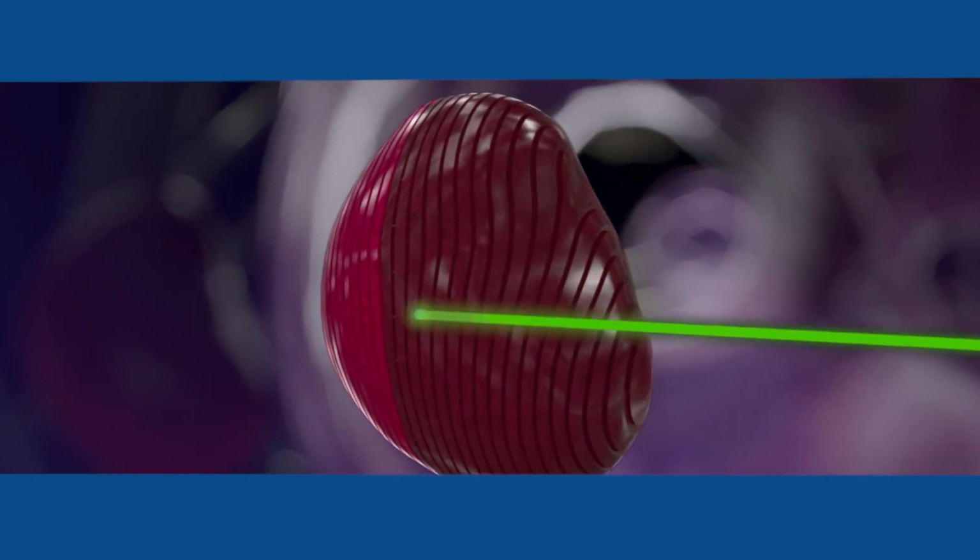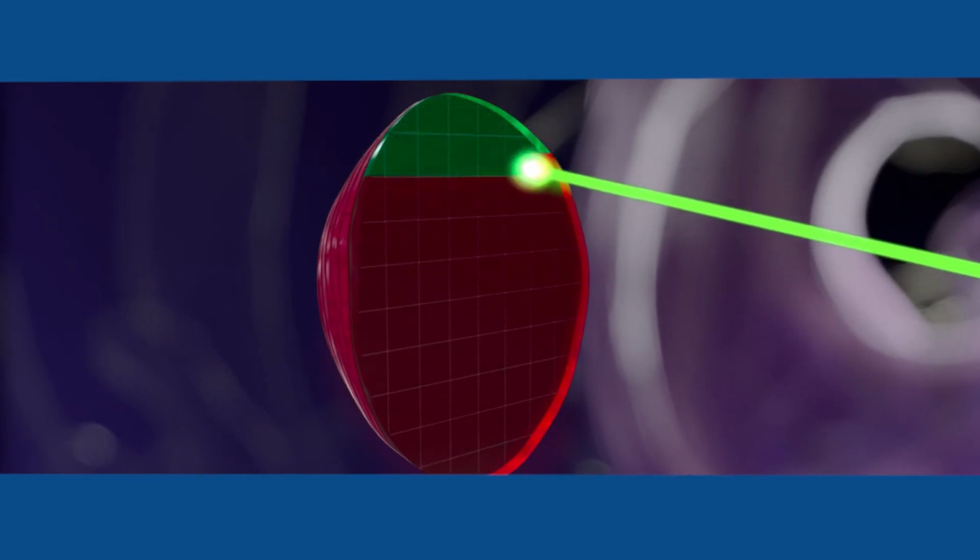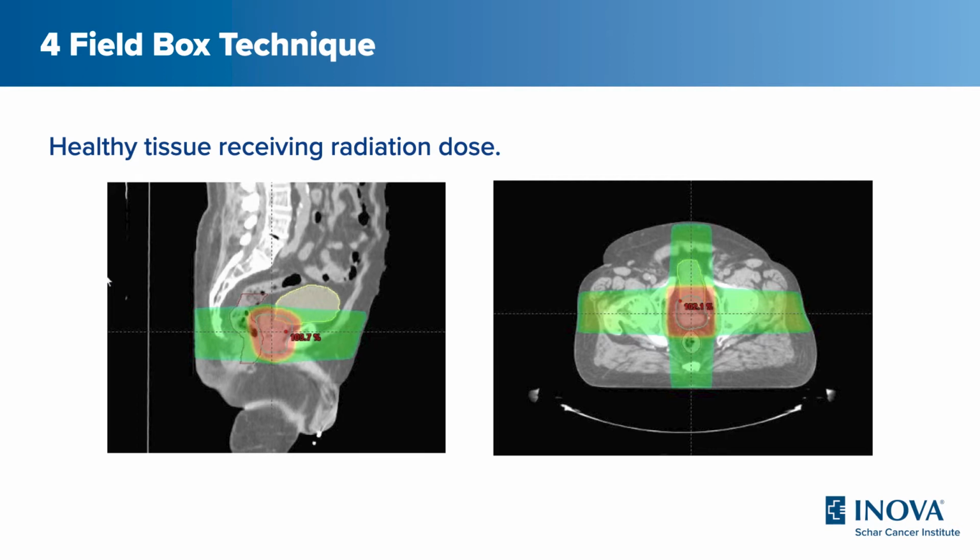One of the technology advancements that we talk about a lot is really done within the treatment machine. Years ago, we didn't have the ability to shape the beam of radiation. We didn't have the ability to protect the healthy tissue. So if someone in your family had had prostate radiation 20 years ago, we would create a rectangular shape of radiation and deliver 4 beams. That's all we had the capability of doing. The patient would receive treatment from the front, from the back, and beams on each side. And what would happen was all of the tissue in that radiation field would get the exact same amount of radiation exposure. The prostate, the bladder, the rectum, all of it was getting the exact same dose.